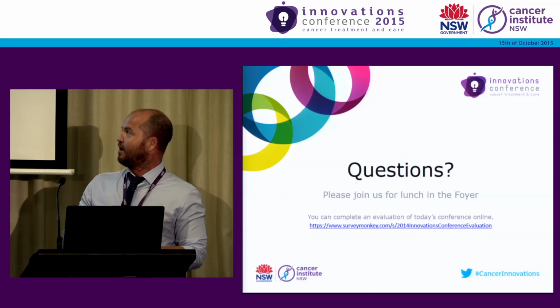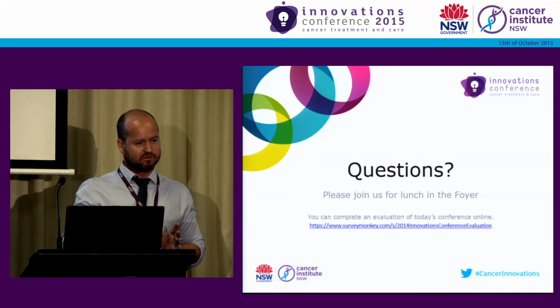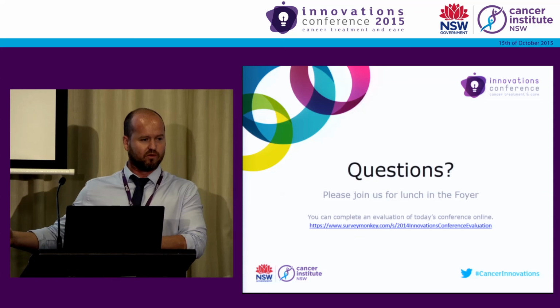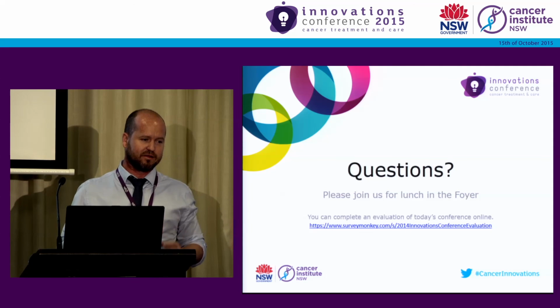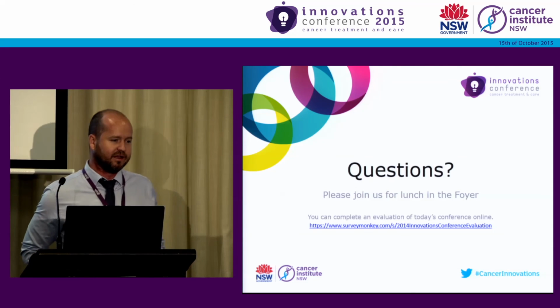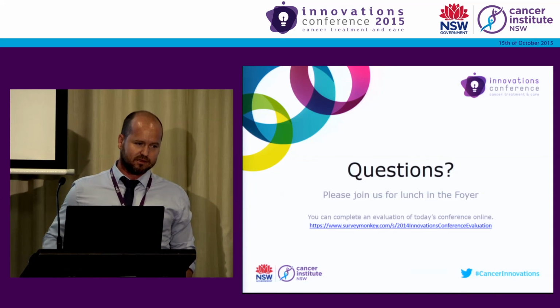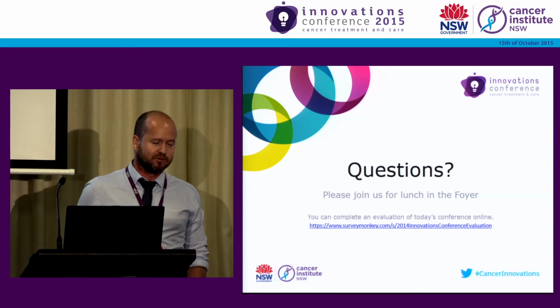Our protocol probably falls down for the conventional guys when an amplitude is exceeded, and that's the cases that we would use 4D cone beam to ensure accurate alignment. But even still, for those larger cases, I think we're probably landing on 4D cone beam being less important for conventional and just solely for SABR. All SABR cases, I would have thought too. Yeah, that's right.